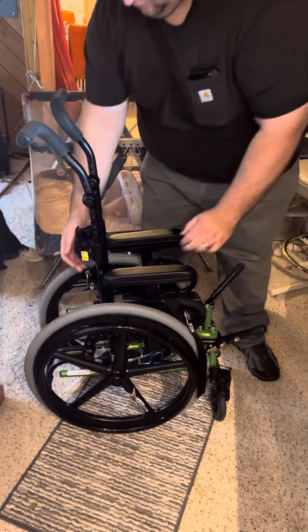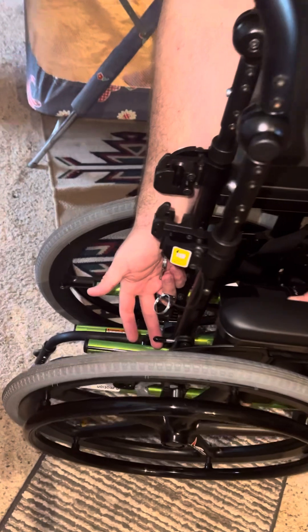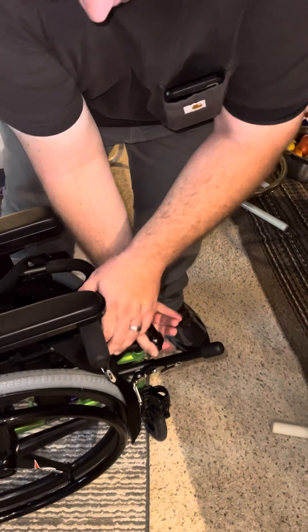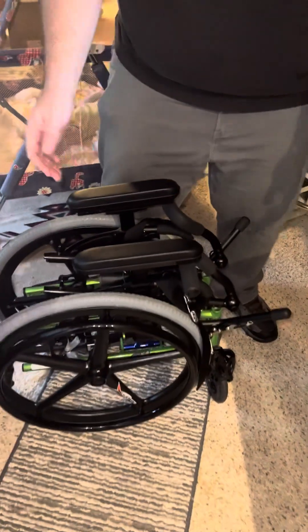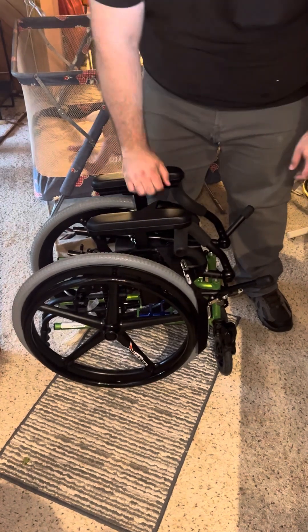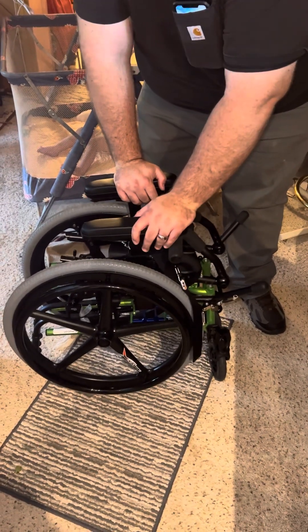It will collapse together like a packing plate. Then you can load it in the car. There's a lever back here — you can drop those down and put them under there. Leave these locks so you can lift from the wheels, then put that in the car.